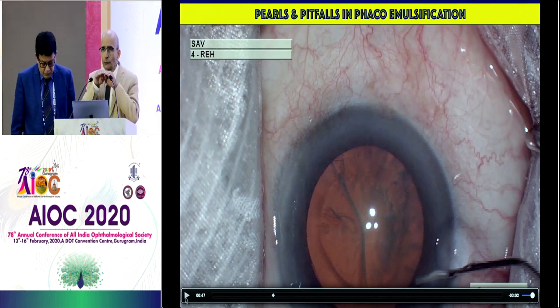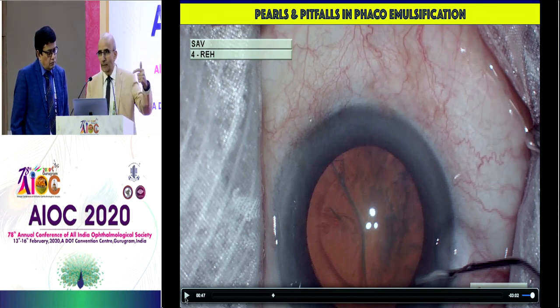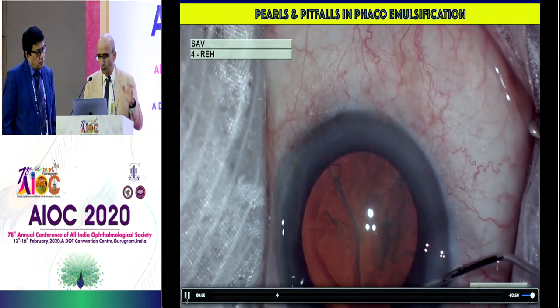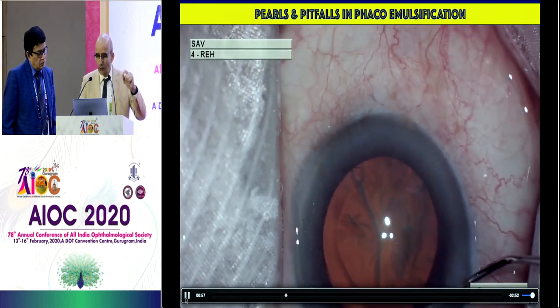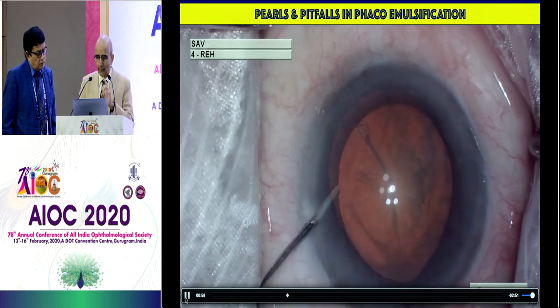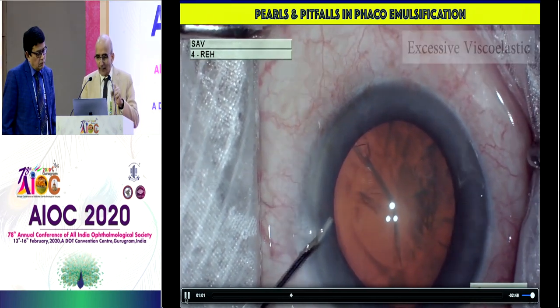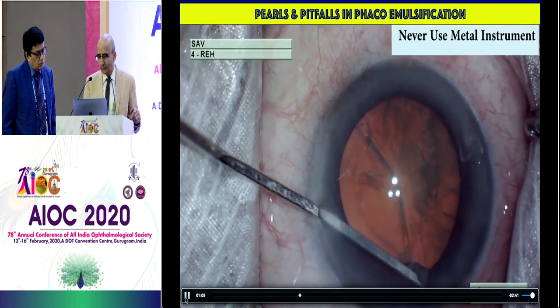A second option would be to go from the side port with the spatula and swipe. Try not to do that either. The best thing is to inject viscoat or methylcellulose — a dispersive or a cohesive — on the iris. But the surgeon struggled here because the other hand did not stabilize the globe. So the viscoat didn't go on top of the iris all the time; it went underneath also, so it didn't help very much. Excessive viscoat was done and then something was caught into the incision.